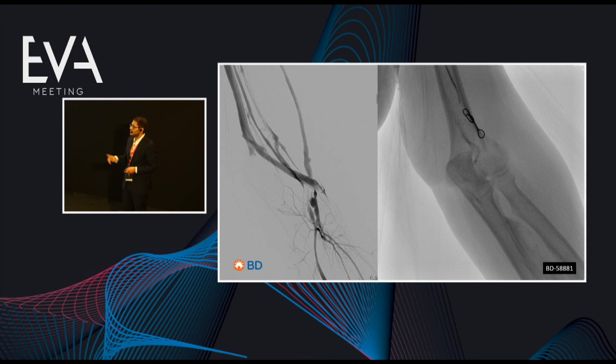It was our decision to coil one of the two brachials, the one that we have our sheath in. So some people might say, you know, we're a bit reluctant about embolizing one of the veins. Ideally, we don't embolize the vein, we're just coiling the vein, and we just make it a bit more difficult for the blood to pick the deep venous system. So a bit more resistance will help the blood to go through the perforator.